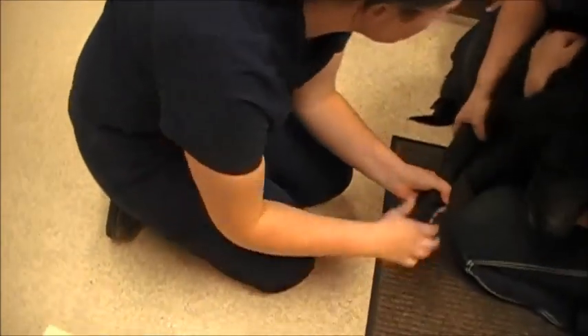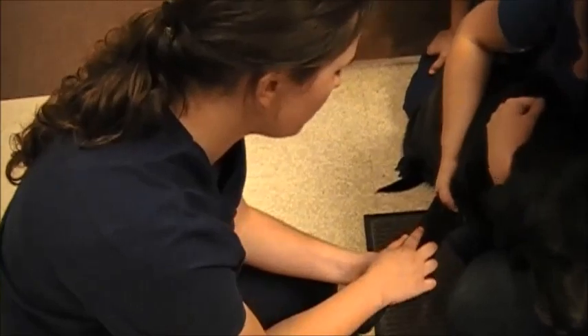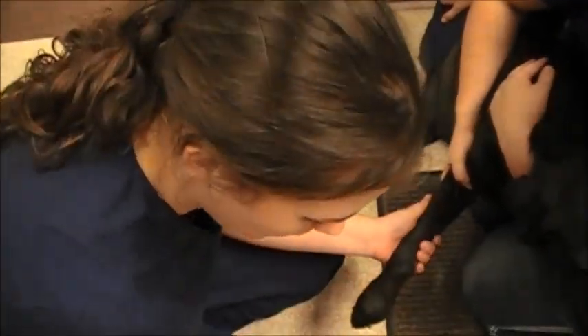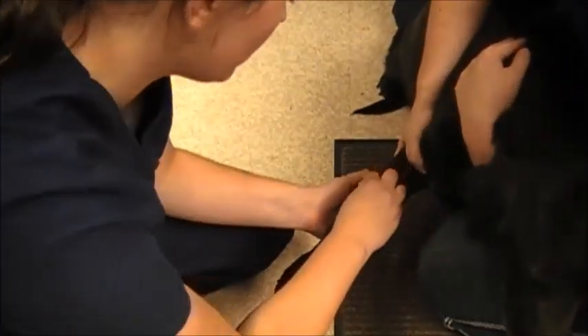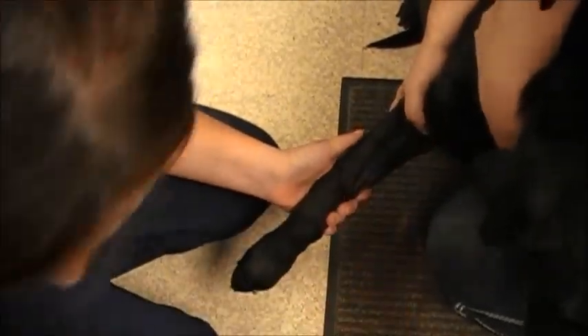So we're going to do the front leg. If you want to pick up her foot and hold off — she's going to hold off the vein. I can palpate and feel right here, and I can also visualize where the vein is. So I'm just going to swab it down with alcohol a couple times to get it clean.